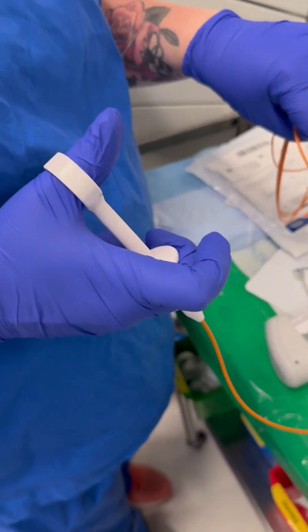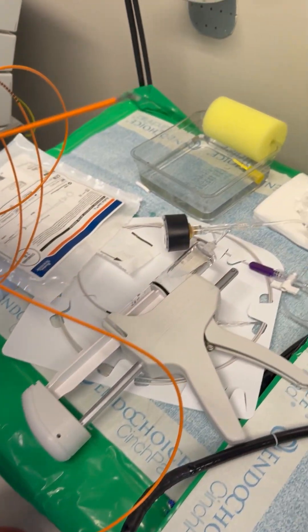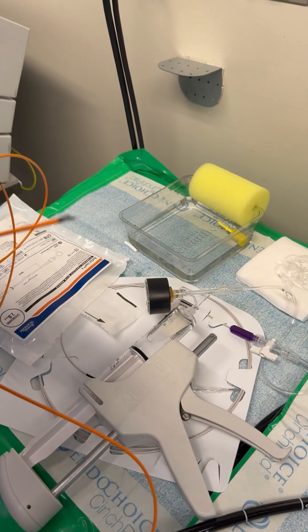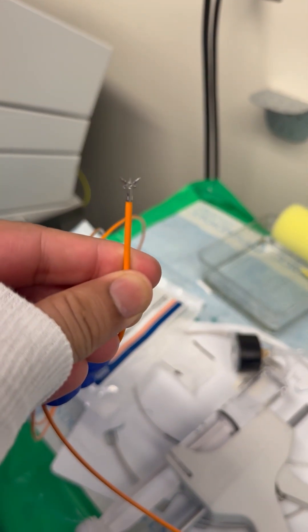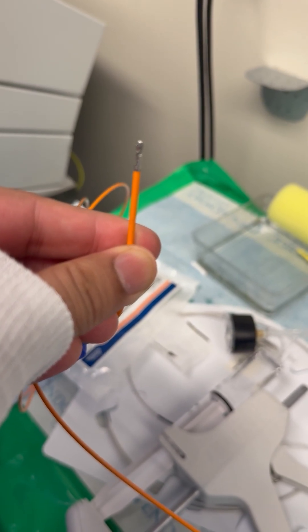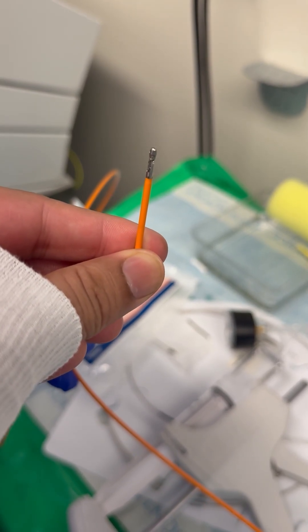This is the plunger. This is the small piece here. This is the part that's used to take the biopsy — small tiny bites that we send to the lab for further analysis. We're diagnosing different types of diseases and conditions.